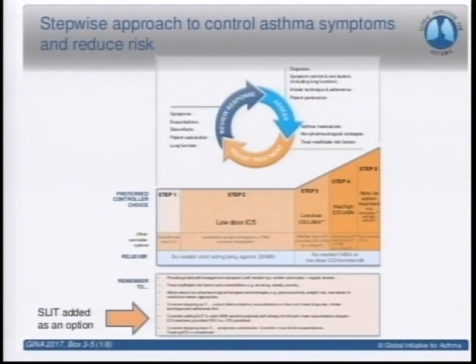And so those are the patients with severe persistent asthma that are at that stage where there's nothing else available. Those are the patients that we typically consider for thermoplasty. Now, most of the studies that have looked at thermoplasty, because they were worried about severe consequences of the therapy, selected the healthier asthma people, even though they were severe persistent. They were healthier, meaning they didn't have very low FEV1, and so that is something that would be considered on a case-by-case basis if someone has very severe obstructive lung disease, whether this should be done or not.